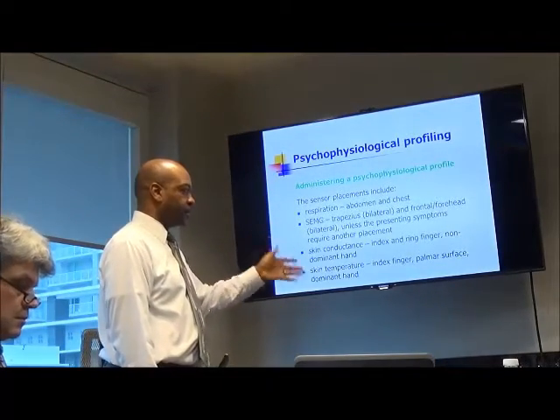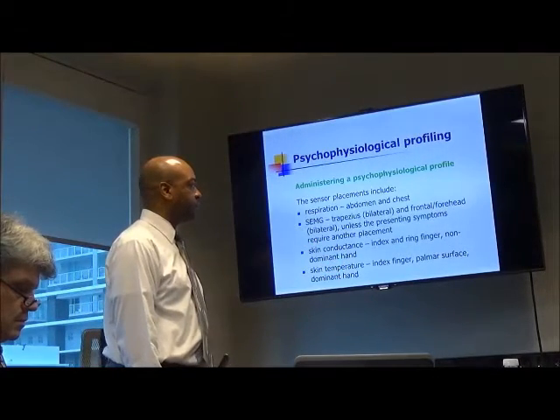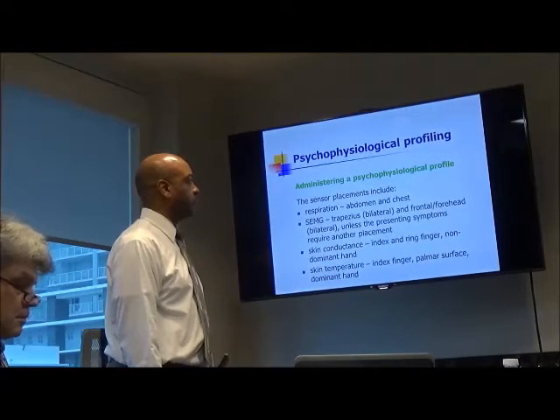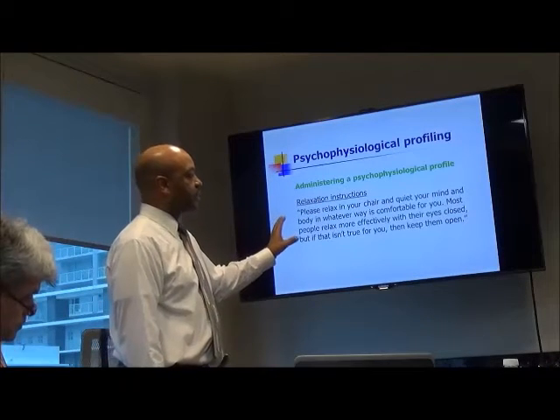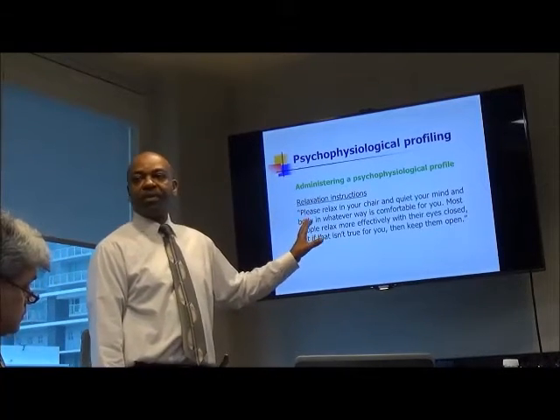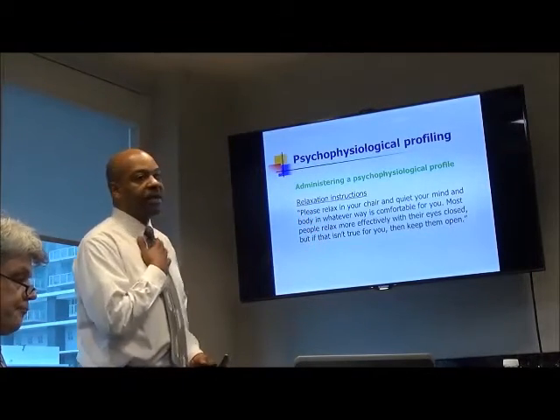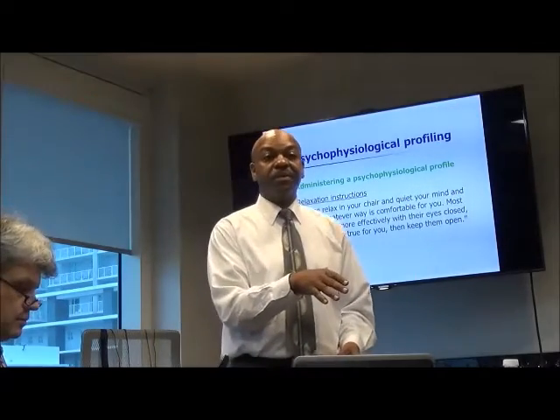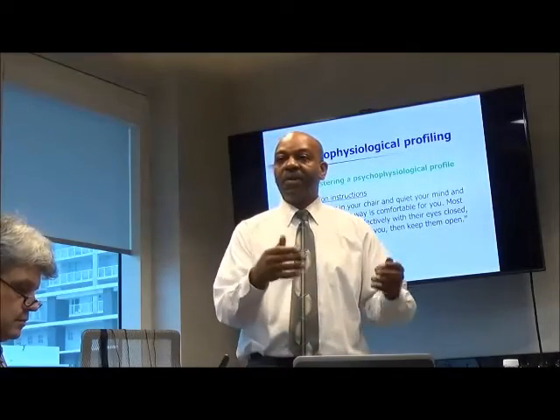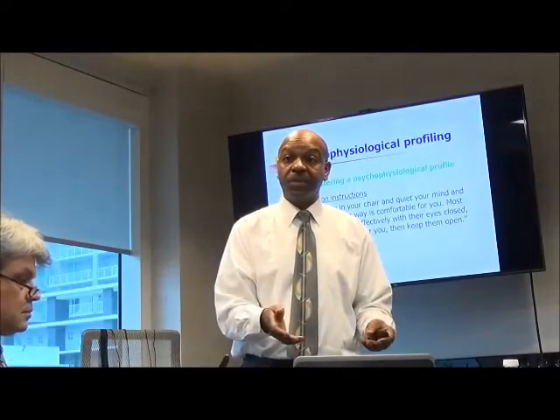Here they're listing the sensors again, and possible placements for them, and you have all of this in your handouts. The relaxation instructions, this is one person's opinion of what the instructions should be. I find it important not to have the screen visible to the patient, except if there's a specific task on the screen for them to do.